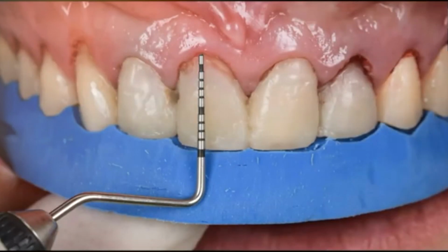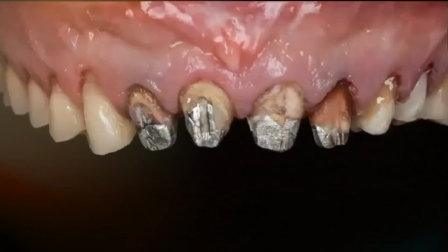We check that everything's okay. I always want to check with a silicone key according to the final design that I have, the length that I planned for and all this. And then I remove the old restorations, and this is what we have under. So this is quite challenging because you need to block both the substrate and the roots.